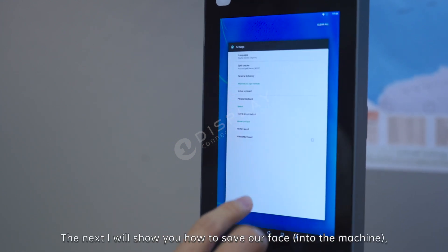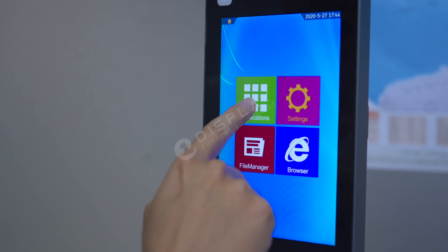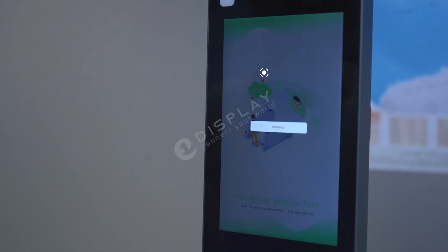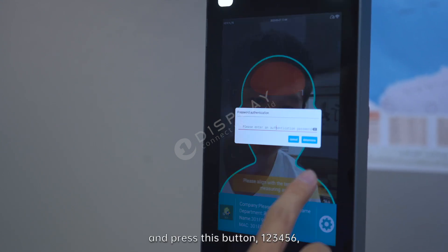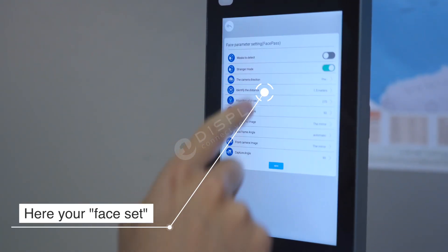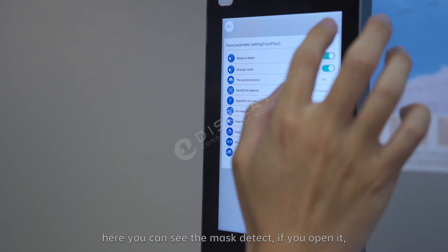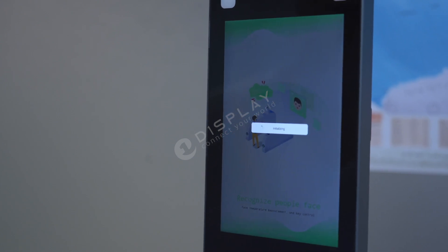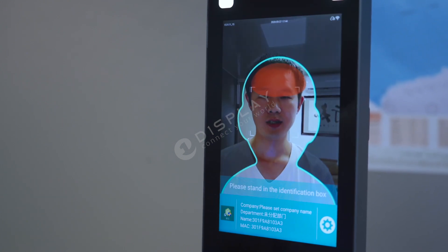Next, I will show you how to save a face. Go to face recognition. Here is the face recognition — press this button to enter the face settings. Here you can see the marks to detect. If you open it and save, the machine will recognize whether I am wearing a mask or not — no mask detected.